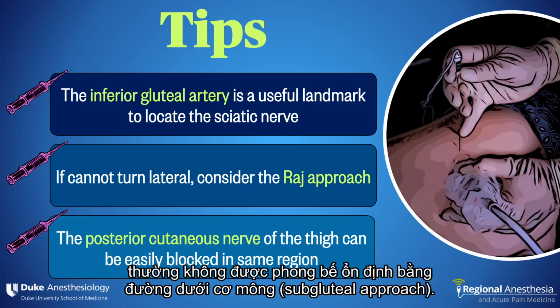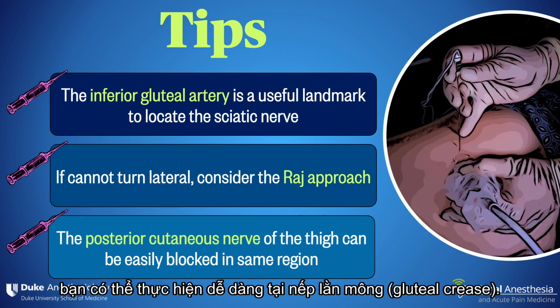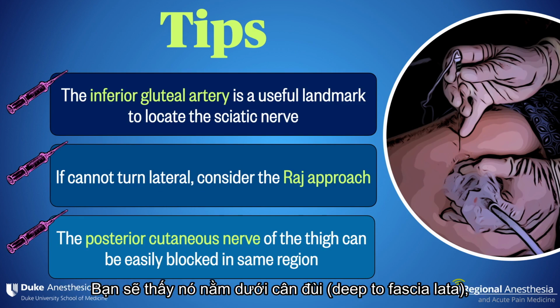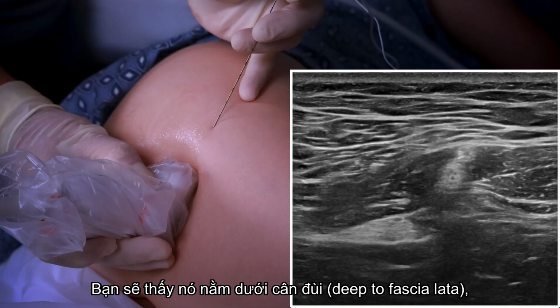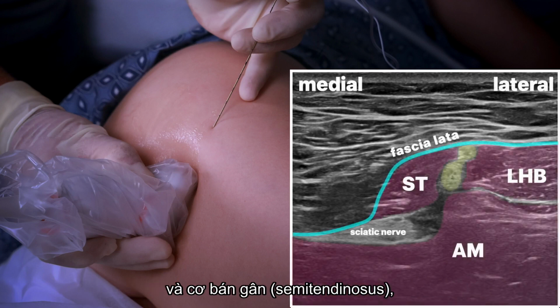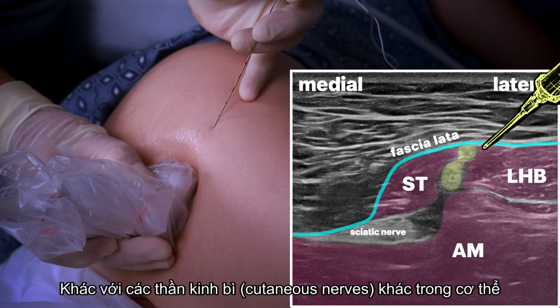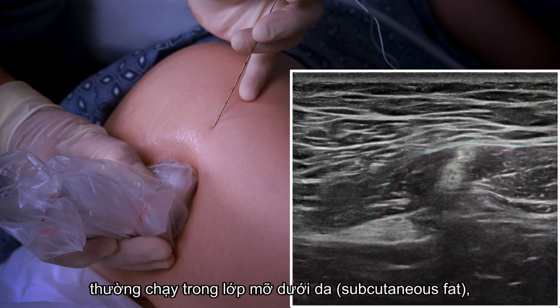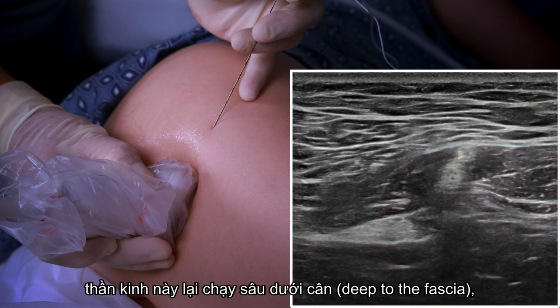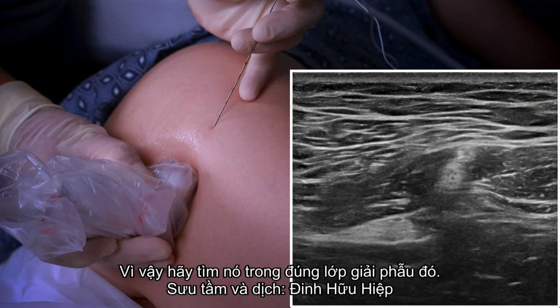Lastly, we know the posterior cutaneous nerve of the thigh is inconsistently blocked with the subgluteal approach. If you do need to get it, say for an above-knee amputation, it can easily be blocked at the gluteal crease. You'll see it deep to the fascia lata between the long head of the biceps and the semitendinosus muscle, as it emerges from the same plane as the sciatic nerve. In contrast to other cutaneous nerves in the body that run on the subcu fat, it runs down the posterior thigh deep to the fascia, giving off perforating skin branches as it goes, so look for it in that plane.